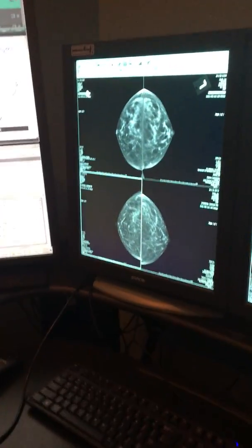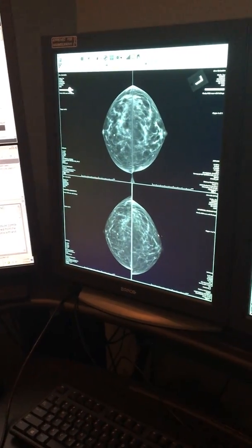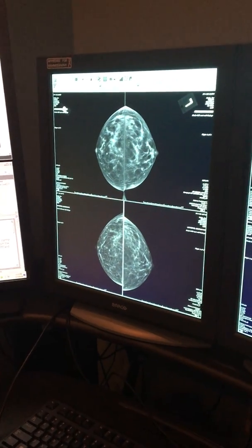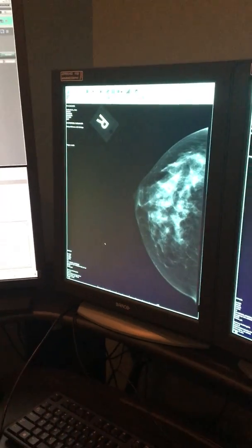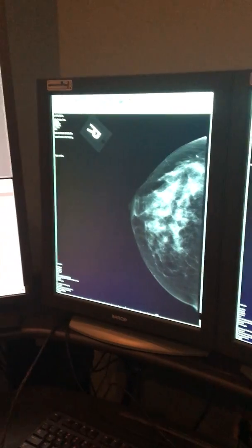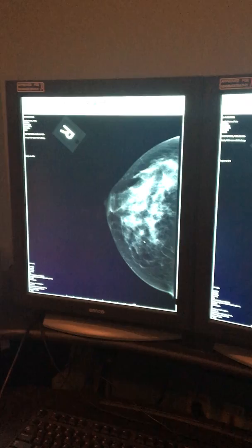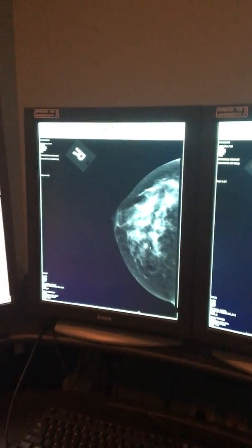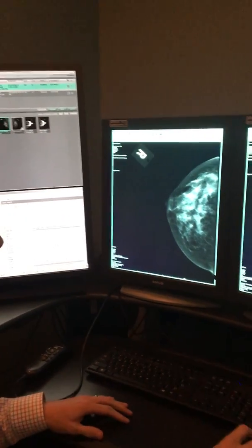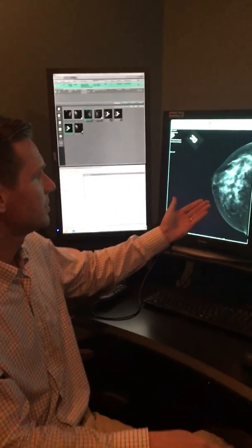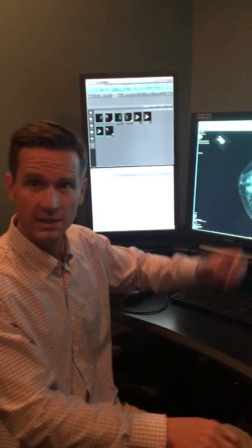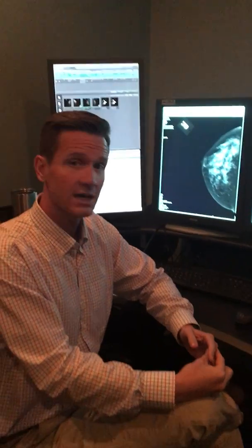This is a category C. I can show you another example of a mammogram where much more of the breast is made up of that white fibroglandular tissue — this one is 50 to 75 percent, so this would also be a category C. You can see that it would be difficult to catch a small mass or something hiding within that dense tissue.